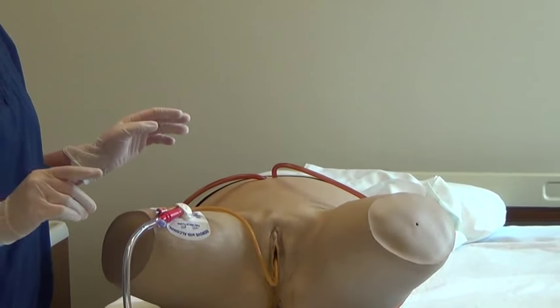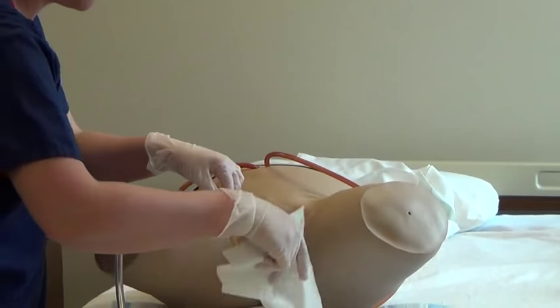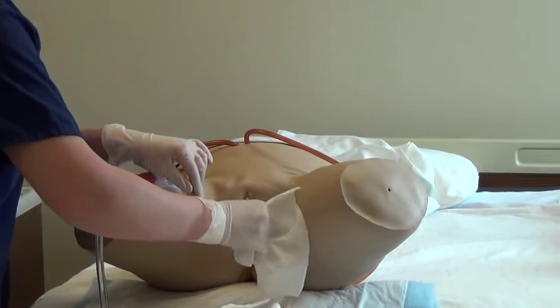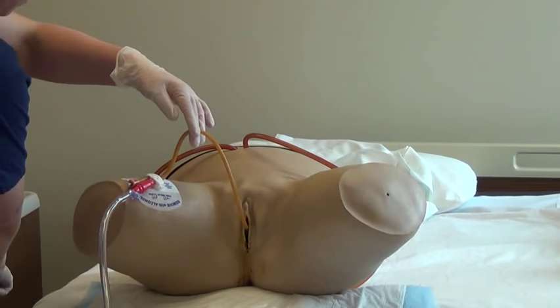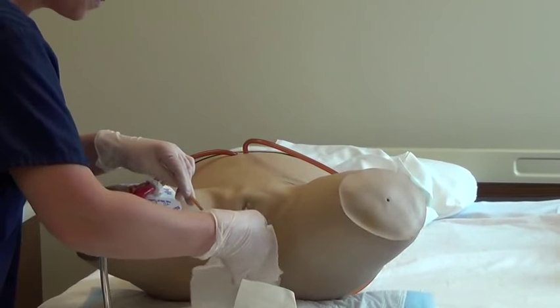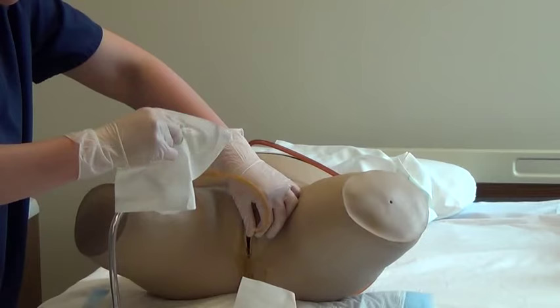For females, with your first wipe, start at the meatal junction and gently cleanse the first 1 to 2 inches of the Foley. Stabilize the Foley with your non-dominant hand while cleaning the remainder of the catheter to the bifurcation. Use your second wipe to clean the meatus and distal labia, or side away from you.